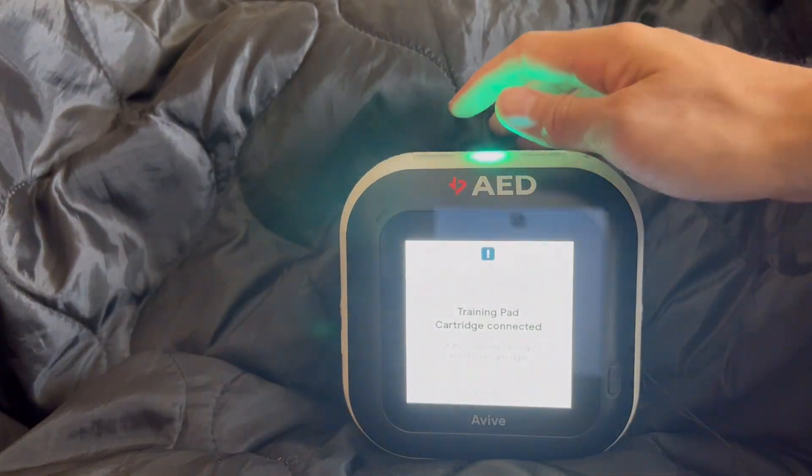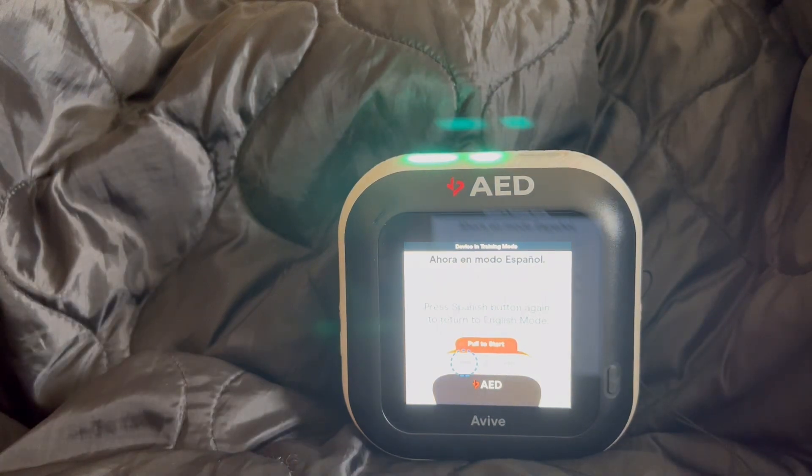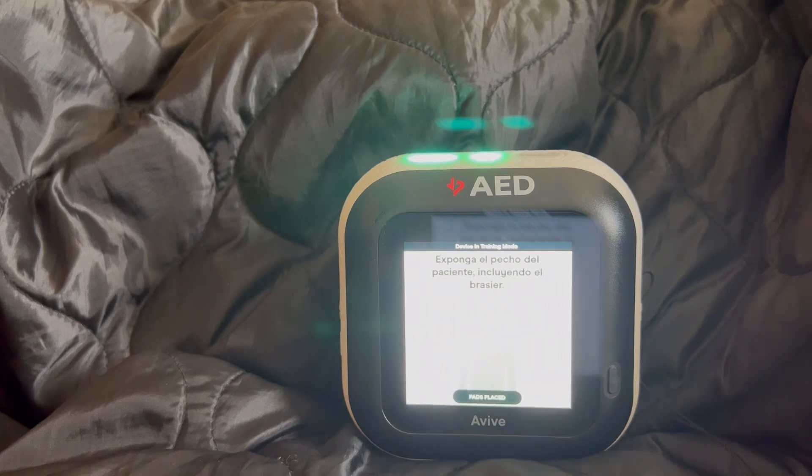Powered on. Spanish button pressed. Ahora en modo español. If the patient is under 8 years old, press the button on the upper side of the device. Exponga the patient's chest, including the brasier.